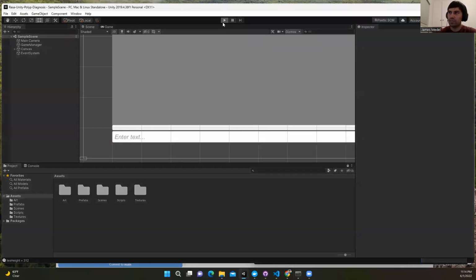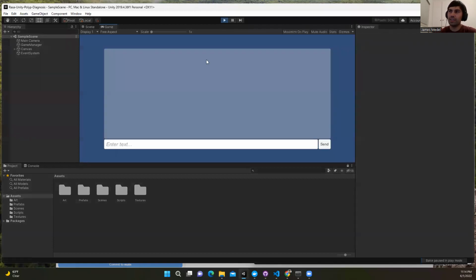We're going to start the application, and so we can just go straight to it. I want a patient polyp classification report. So we'll send it. Okay, so Rasa lets us know what the patient IDs are and which one we want for the classification report. And we can say 1.